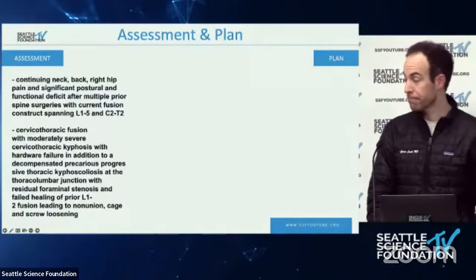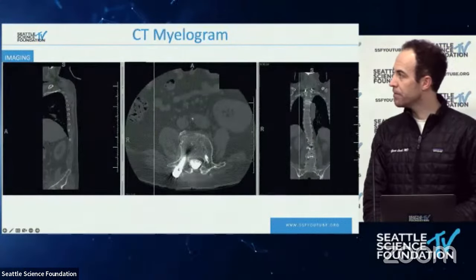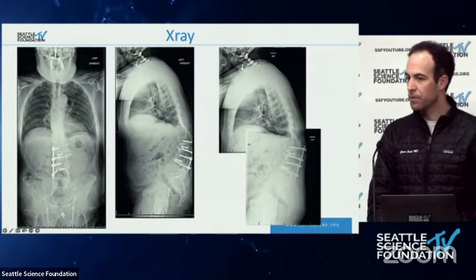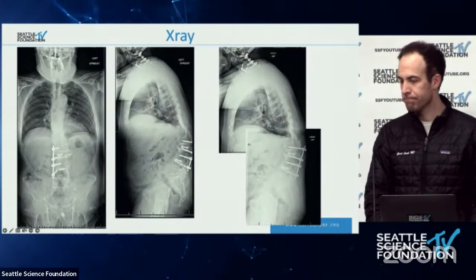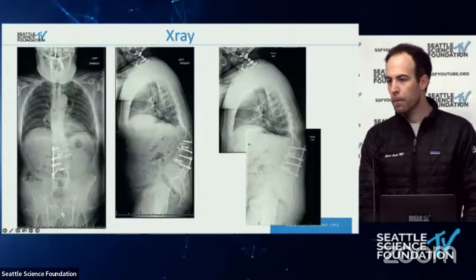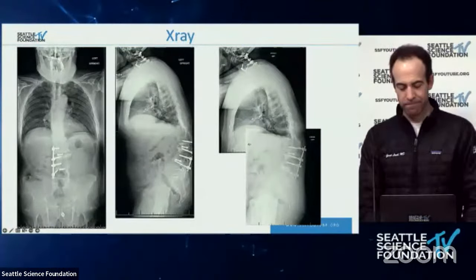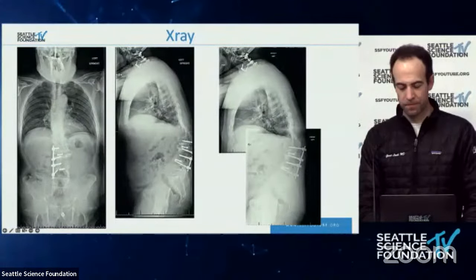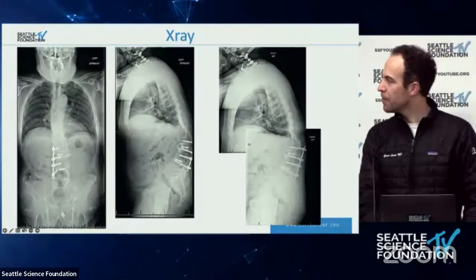So far. Yeah. Go back to the initial survey shots. I don't even know how many surgeries he's now had. He's had multiple neck surgeries and then multiple low back surgeries. And a lot of those, actually, it all started with MIS, and he's had just this escalation of MIS surgeries over time. He was never formally fused at L5-S1. So again, same theme as before, a slightly different variant.